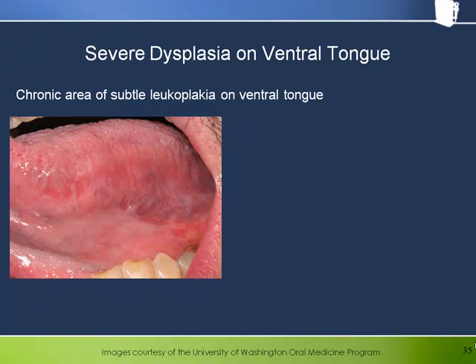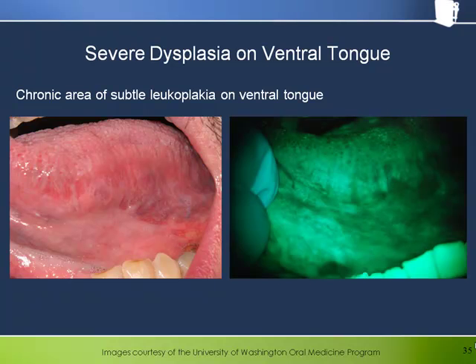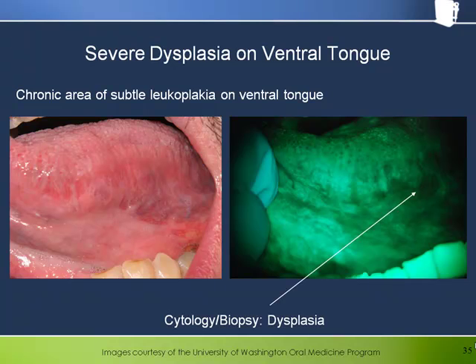Here is a worrisome looking area under white light that becomes more so after the unusual, irregularly shaped dark area becomes apparent under Velscope. There is little to suggest this particular morphology based on the presentation under white light, and this makes it all the more troubling. Cytology and biopsy showed there to be dysplasia in the area indicated by the arrow.